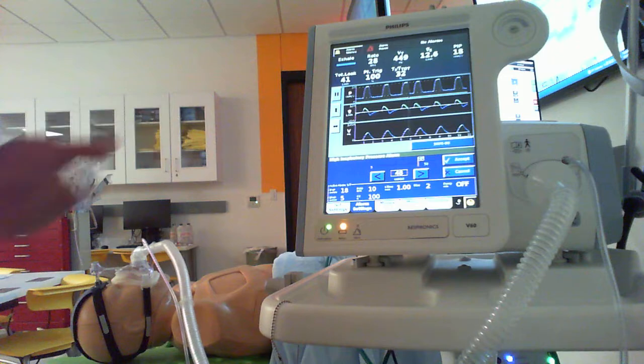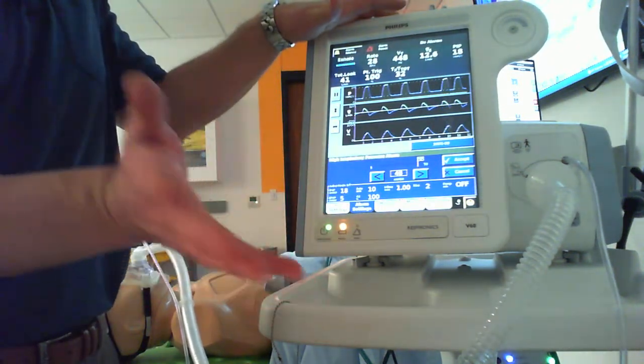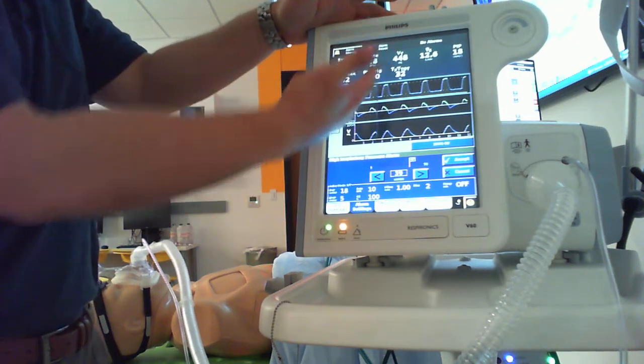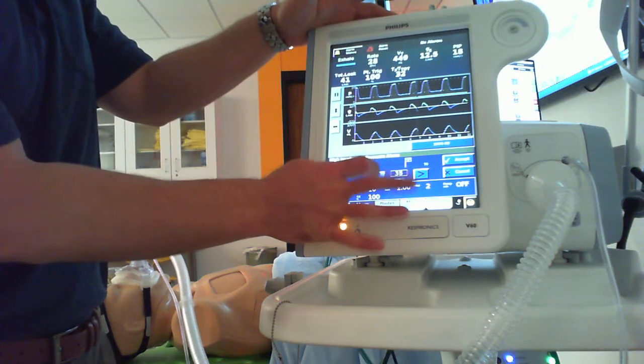flow. Okay, so if they cough right at the beginning of a breath or something weird happened, it's just making sure that we don't give an unnecessarily high pressure to this patient. I generally set it 5 or 10 above my current PIP, okay, some nice easy number. We can set this at 25, okay?